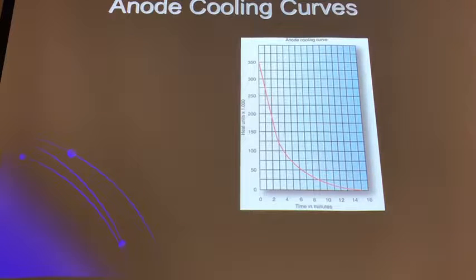Just to give you a sense of how long it took. Nowadays, you can do an abdomen. Well, let's include the chest. Chest, abdomen, and pelvis, you can do it probably in 12 seconds. Go boom. Just 12 seconds.